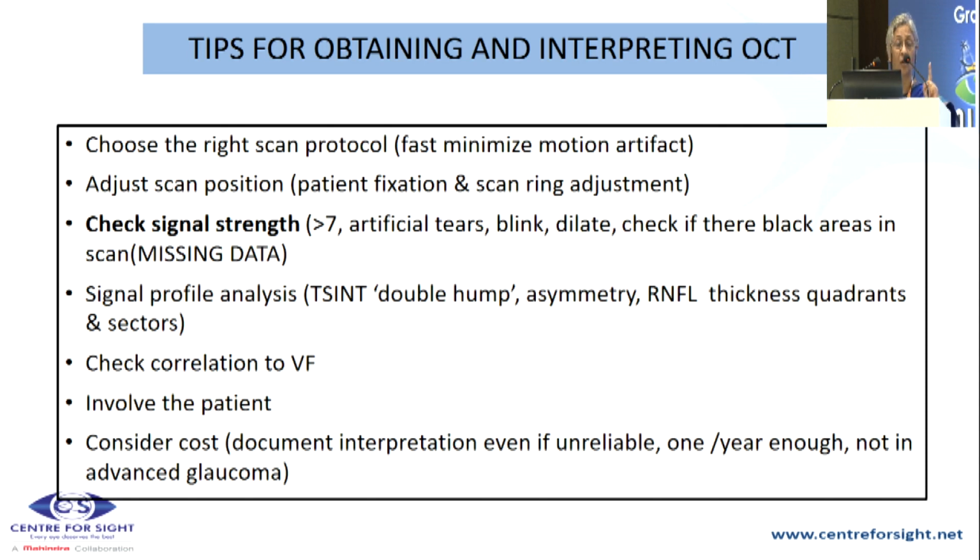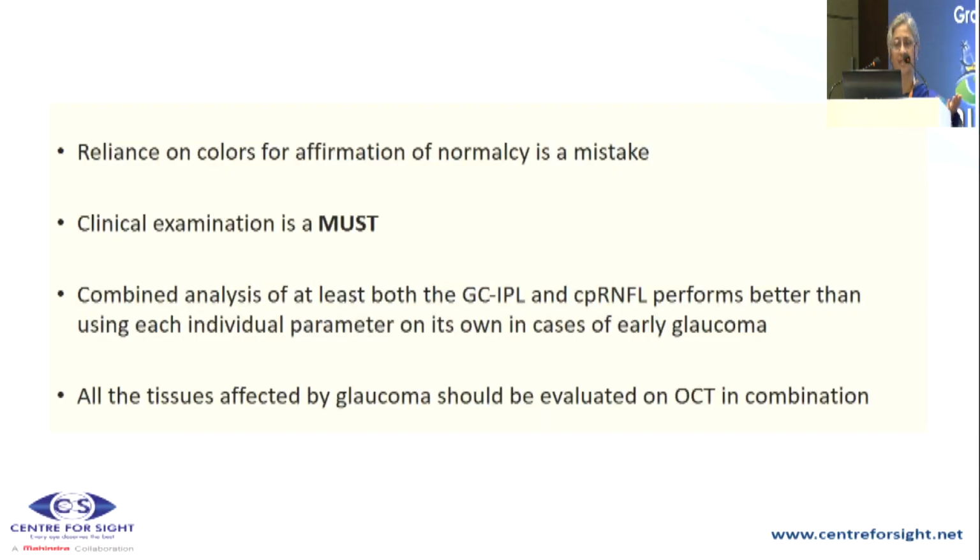Please do consider the cost. Do not do it for a patient who does not require it. Do not do it at 6 monthly intervals. Makes no sense. Do not rely on the colors. I've seen green, I've seen yellow, and therefore this is all right. No, that's not the correct thing.